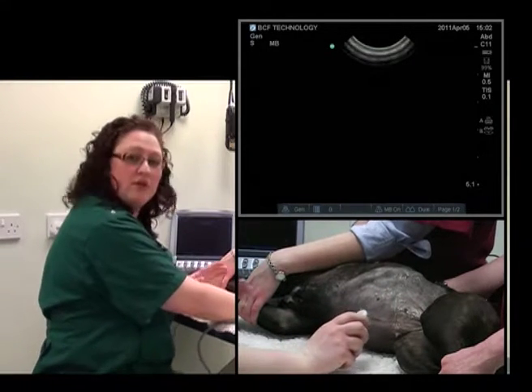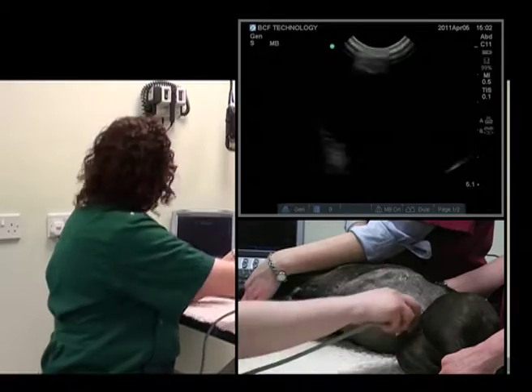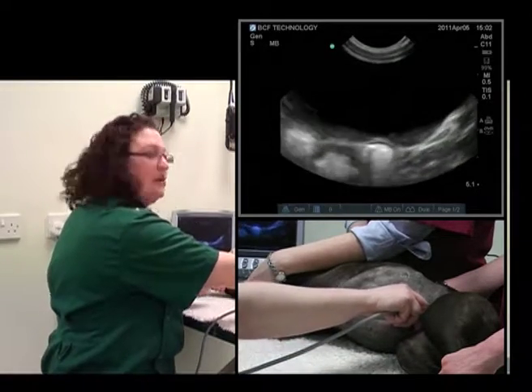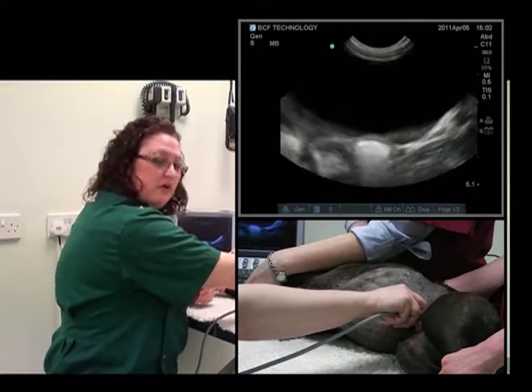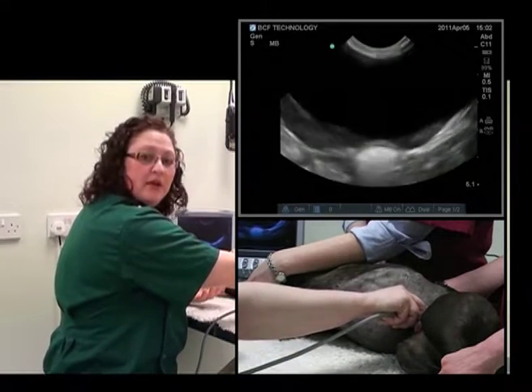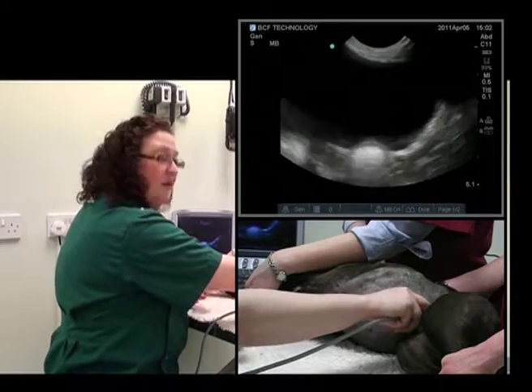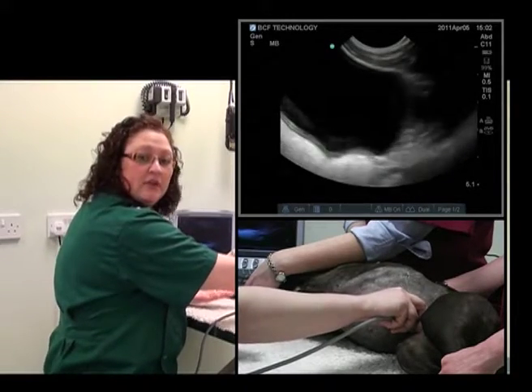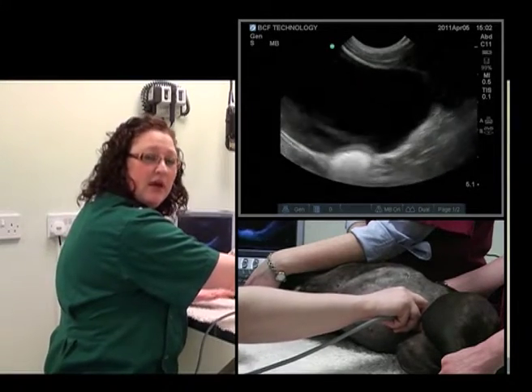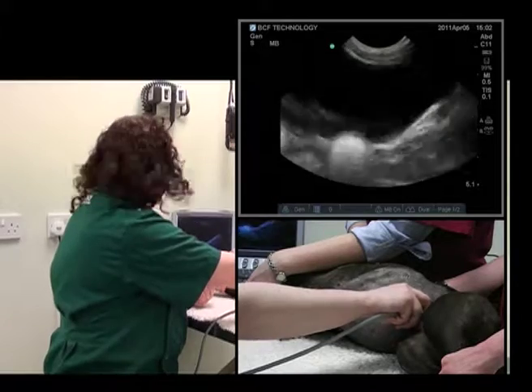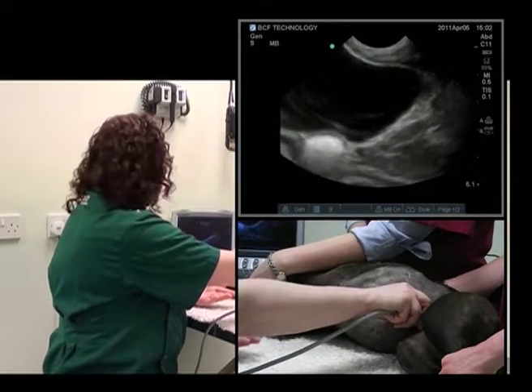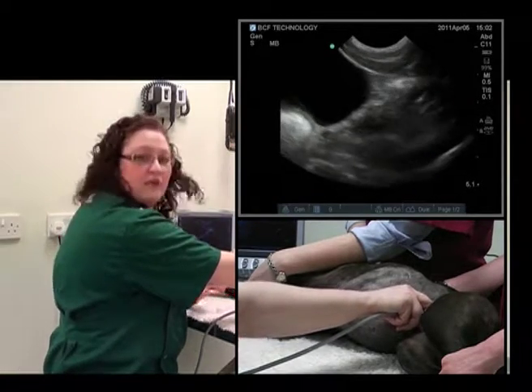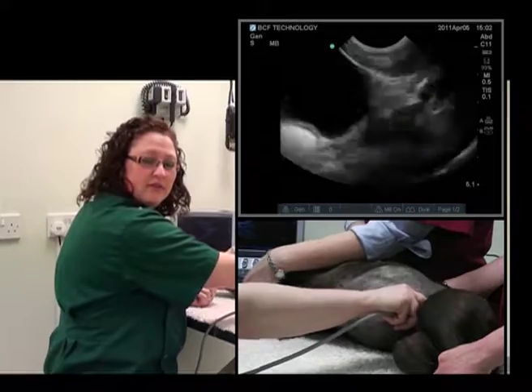What you can also do while in this area is if you are worried about there being a pyometra, a stump pyometra, or also looking at the prostate of a male dog, you can actually proceed a bit further caudally and evaluate those organs as well.